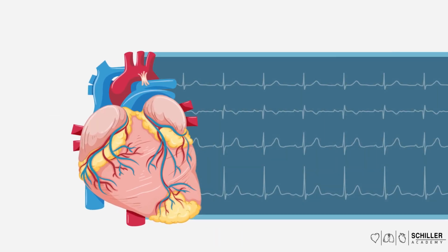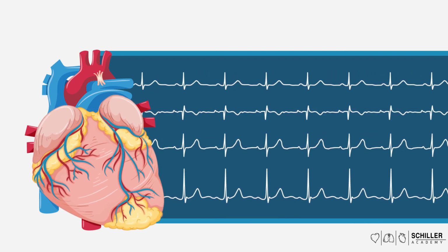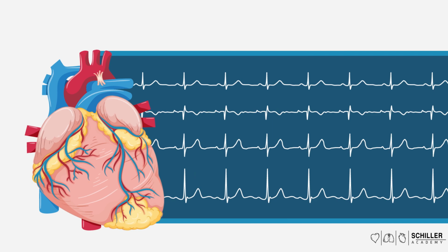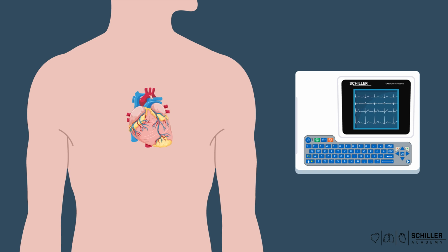An electrocardiogram, short ECG, is a diagnostic tool that records the electrical activity of the heart. Any metabolic tissue alteration due to many different pathologies reflects on cardiac electrical activity and thus on ECG. This is why ECG remains a fundamental tool in cardiac disease detection.